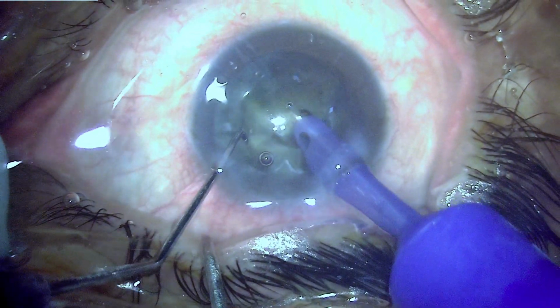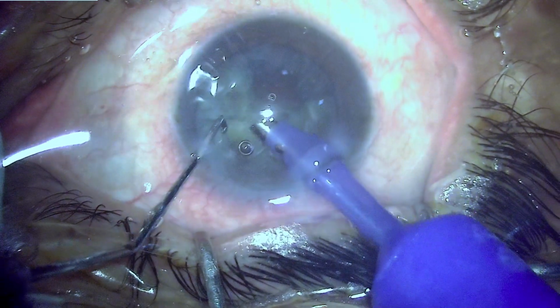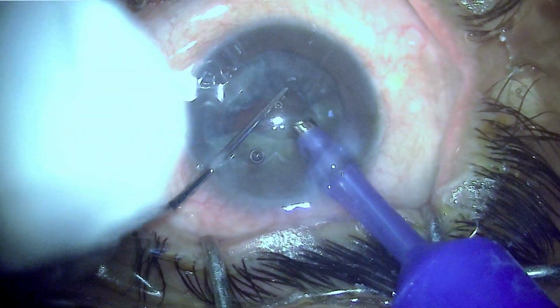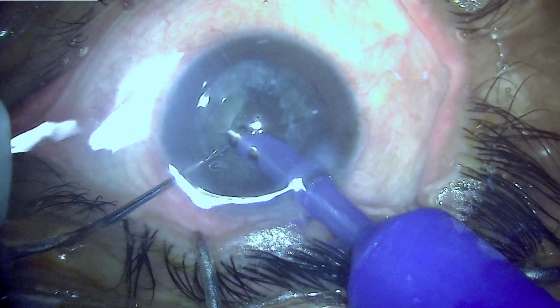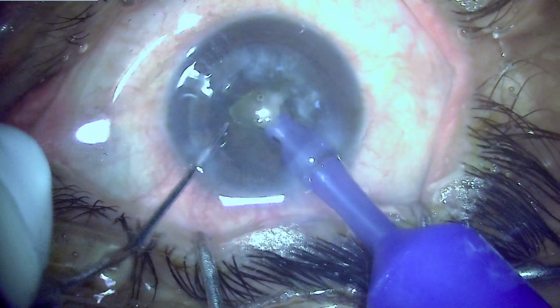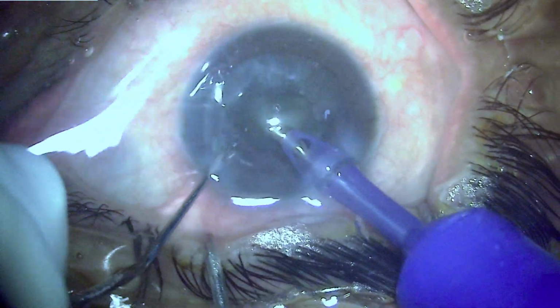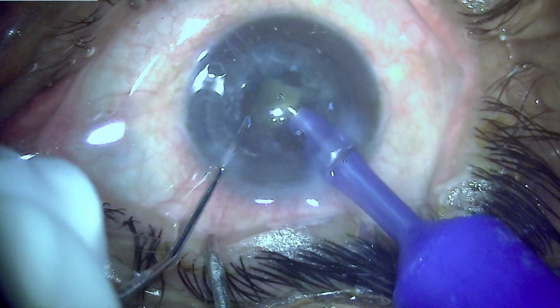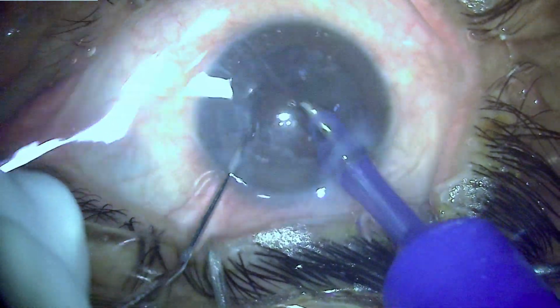This portion of the video is being run at 1.5 times the normal speed just to expedite this process, which is not so important for this particular situation, where here we are more concerned about issues arising during the surgery in these patients who have had radial keratotomy, which universally weakens these corneas in these scar areas. So one has to be vigilant, although in this patient no unwanted accident happened, that any scar would have ruptured or dehiscence in the cornea was not seen.